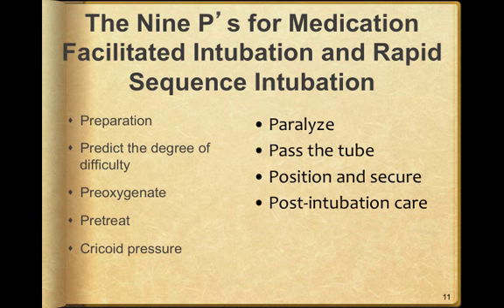For post-intubation care, be sure that all your tapes and such are not too tight, or your aftermarket device to hold down the tube. Be sure you're adequately ventilating the patient. And be sure they are sedated, and stay sedated during the paralyzation.